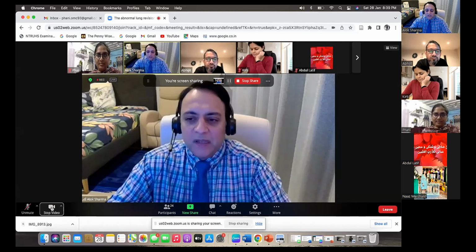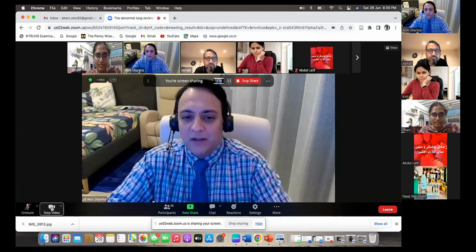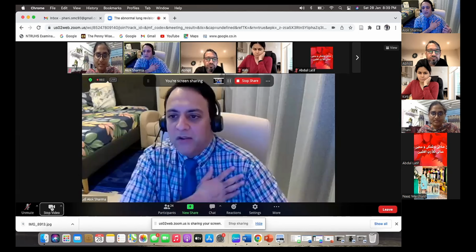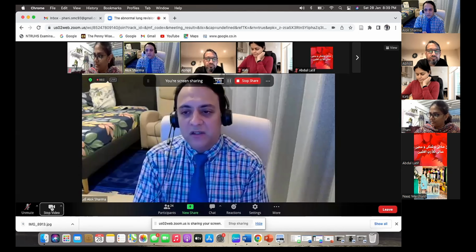Similarly, when you're on the back, there's the scapula. The posterior regions can be quite challenging to get really good images at 90 degrees. One thing I sometimes do to get the back straight is put a small shoulder roll under the baby, in particular under the shoulder, to get the shoulder straight. I'll also try to image quite lateral to the spine.